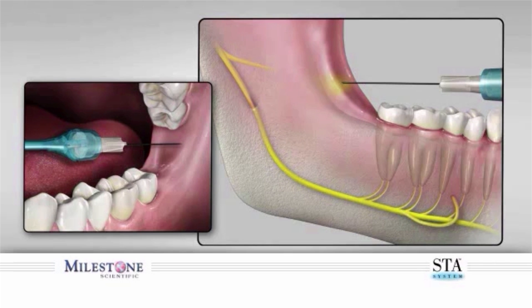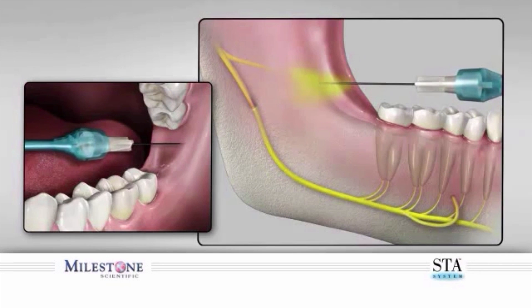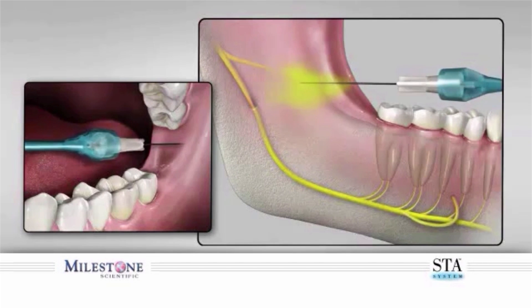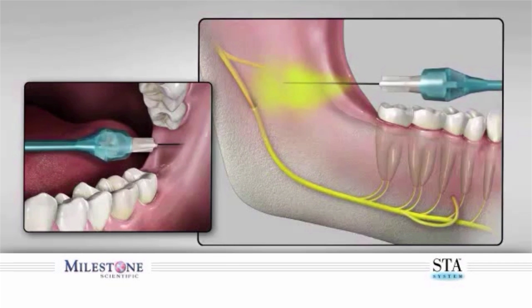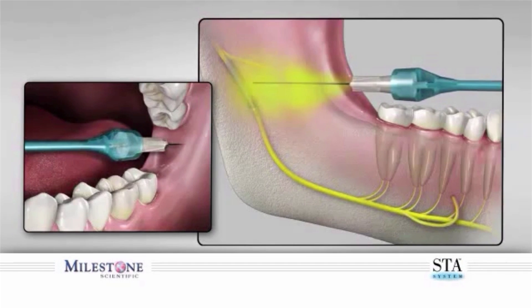Slowly advance the wand handpiece and simultaneously rotate the handpiece using a clockwise and counter-clockwise motion, which is called the bi-rotational insertion technique. This technique will minimize needle deflection, resulting in more accurate placement of the needle tip to the intended target. Advance the needle until bone is contacted. The final target is the medial aspect of the ramus within the infratemporal fossa.